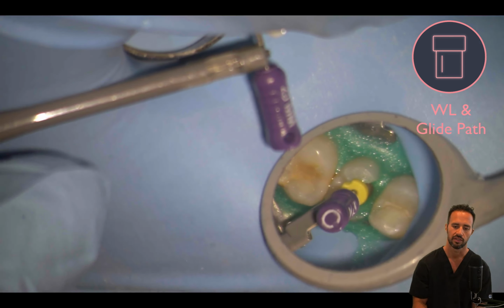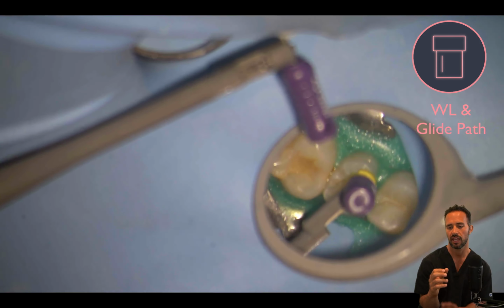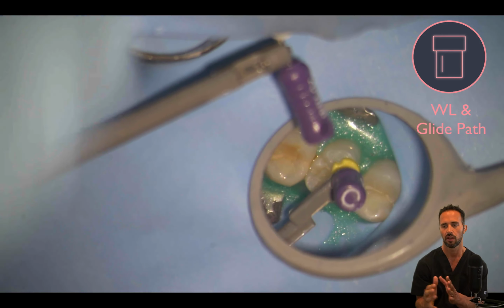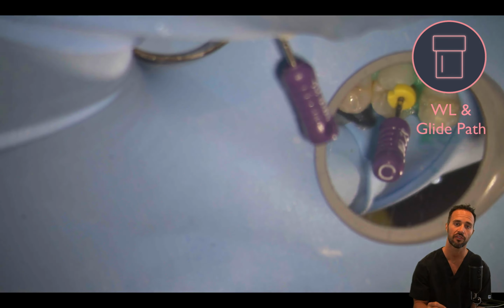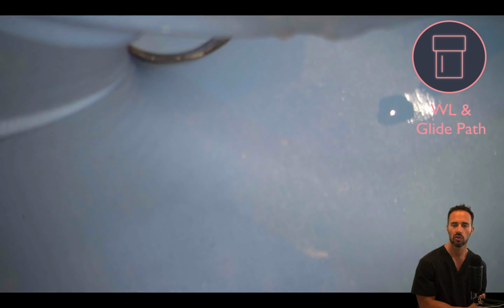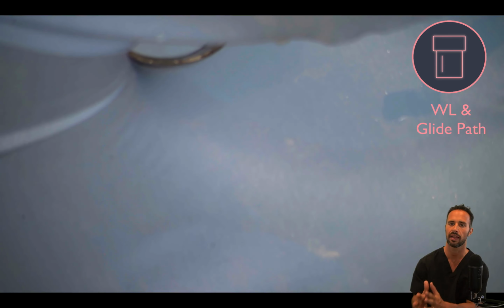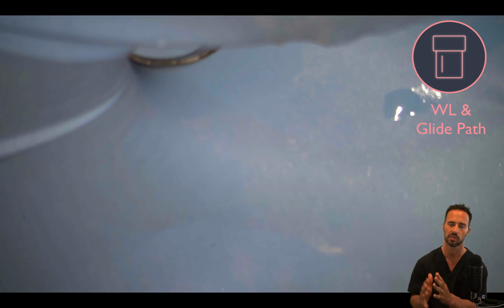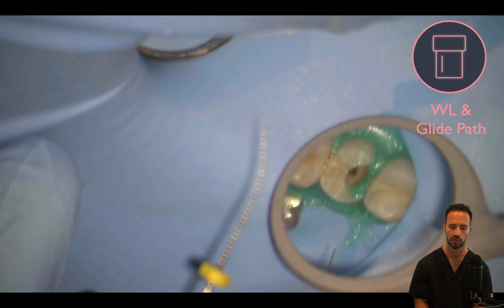So take your time. Also, I recommend for cases with multiple canals to be very, very clear and consistent as to what your reference points are. And so for the buccal canal, I utilize the buccal cusp as the reference point. And for the palatal canal, I utilize the palatal cusp tip as the reference point. Okay? So I'm just recording those measurements.